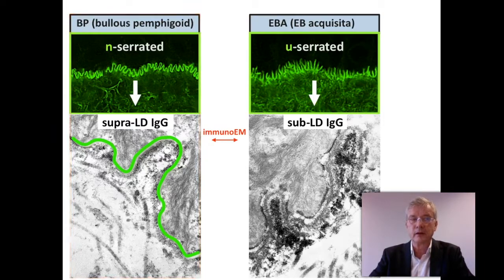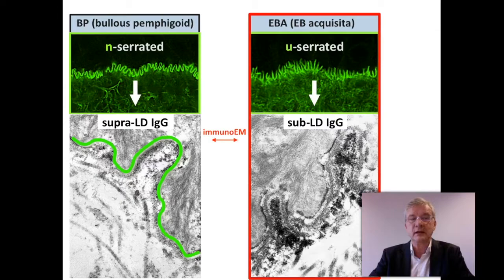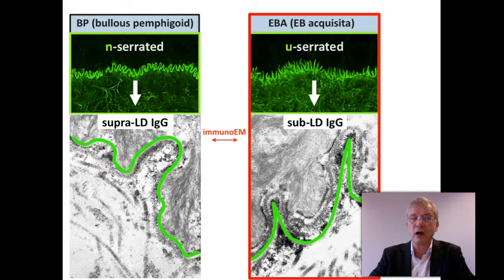The u-serrated pattern in EBA has a deposition below the lamina densa with a pattern of grass-like arms that looks like a u.